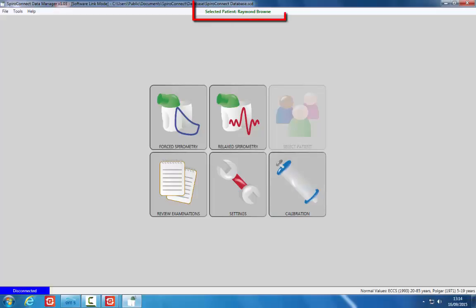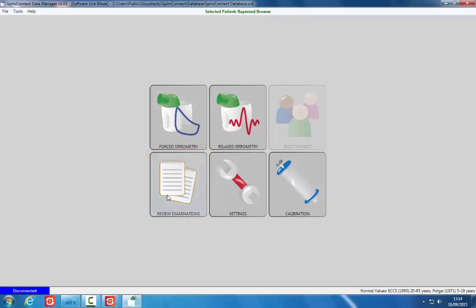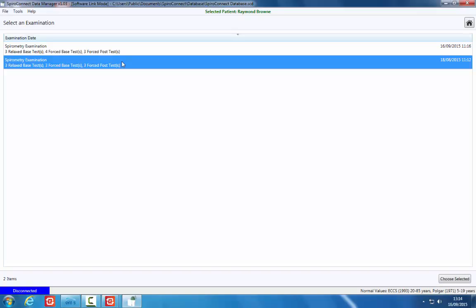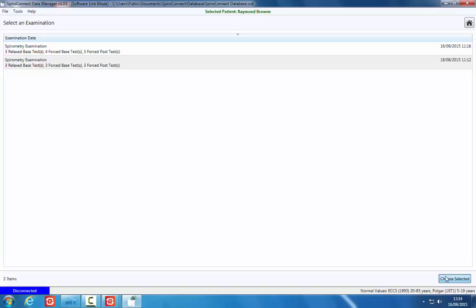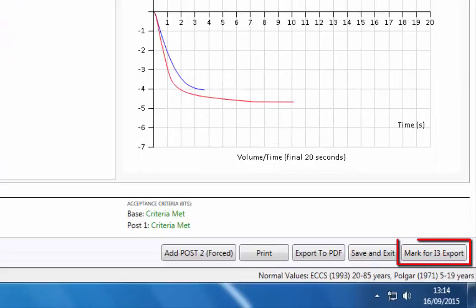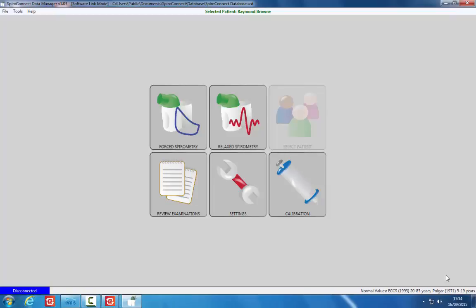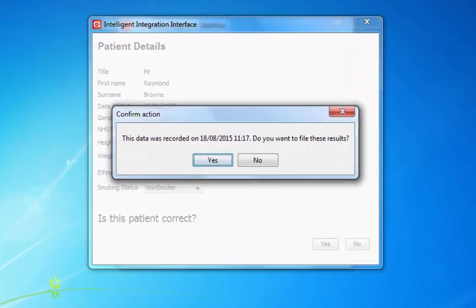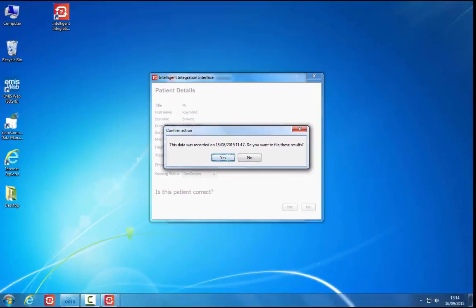The SpiroConnect software will start with the patient's details loaded. Click the Review Examinations button — a list of examinations for the selected patient will be shown. Click on the examination to be exported and filed, then click the Choose Selected button. The spirometry examination will be displayed and can be reviewed on screen. To export and file to the clinical system, click the Mark for i3 Export button. This will return the software to the home screen. Exit the SpiroConnect software. A warning will be displayed that the results are historic, showing the date and time the examination was performed. Confirm these are the results you would like to file by clicking Yes.